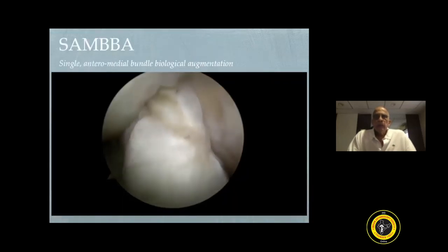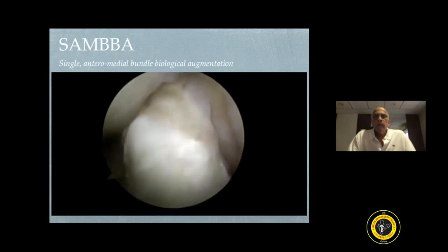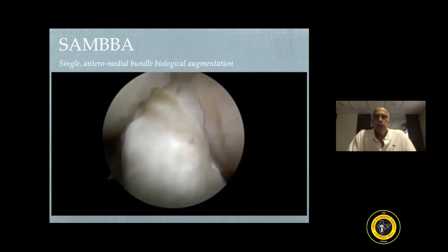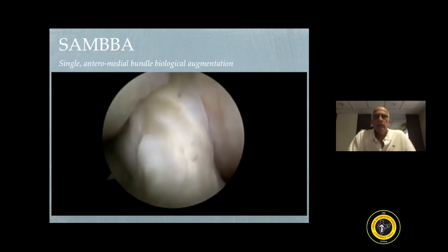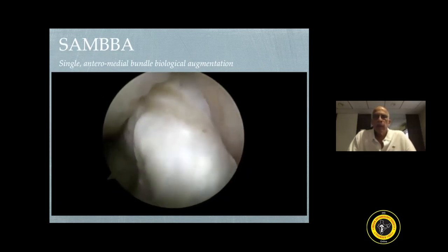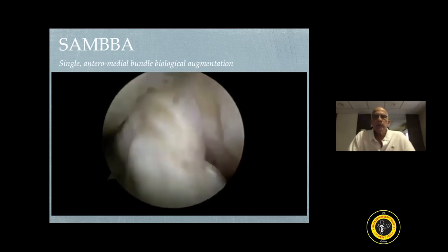The Samba technique is one in which you preserve the native stump of the ACL. You can see the shaver coming through the tibial tunnel — what you see is something like a Samba dance, and hence it is called the Samba technique. Basically what it emphasizes is preservation of the native ACL.